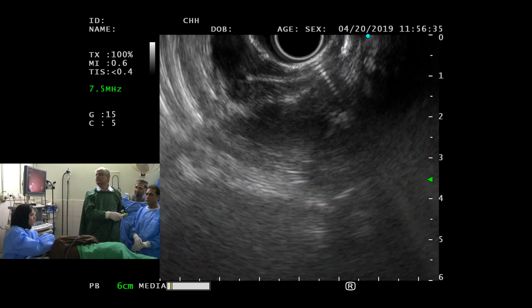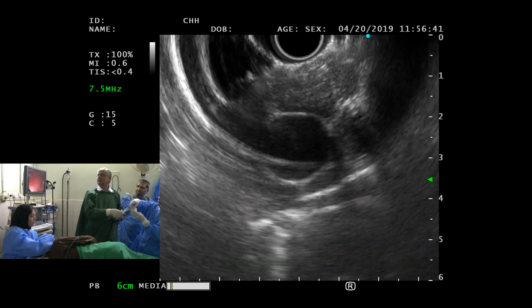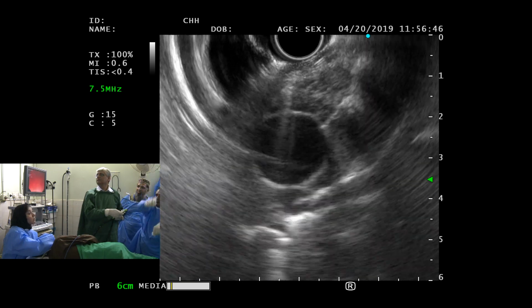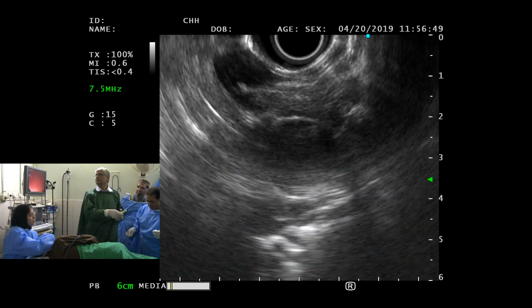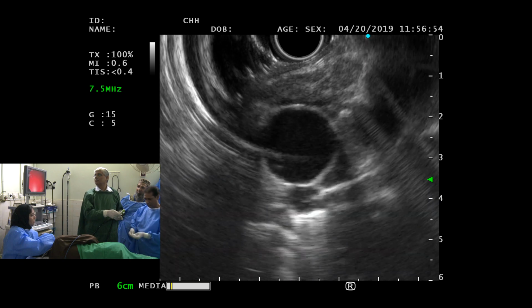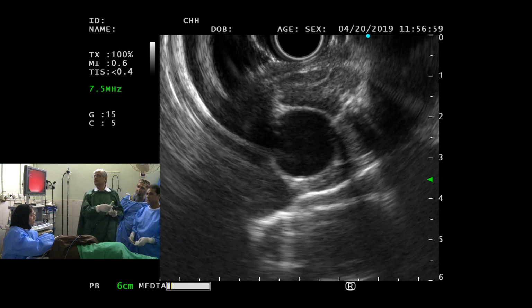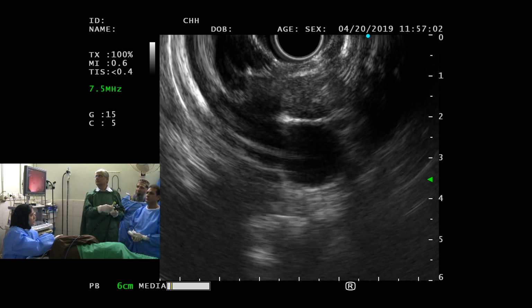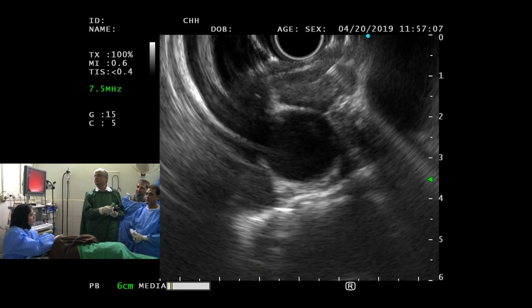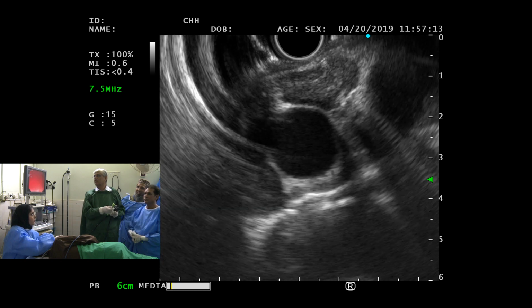Okay, we are in the lymph node. I think that's just the lower part of it, right? Yeah, for now. I've got one area, but it's not as soft as I thought. Right there is bad. Now you are in the perfect place. Yep, there you go, very nice. Hard or soft inside? You can change the trajectory a little bit.